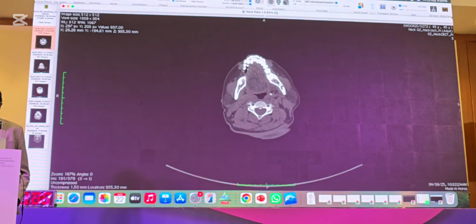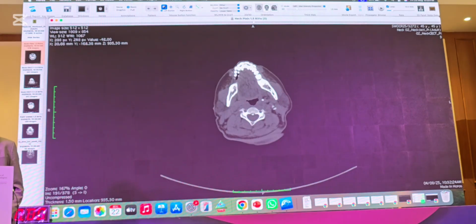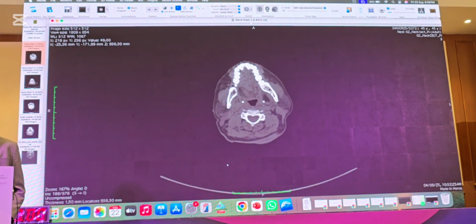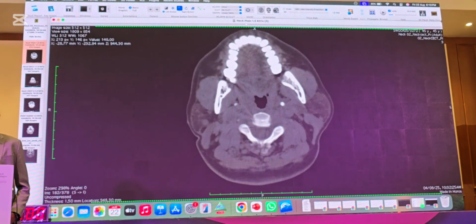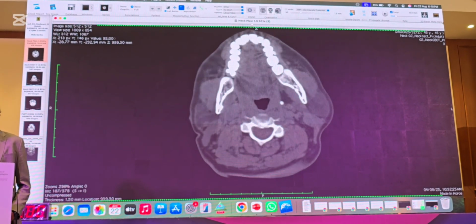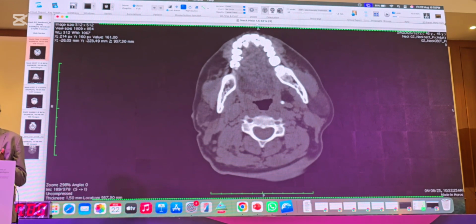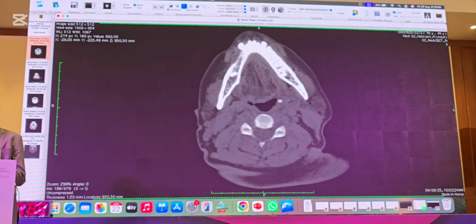So you can see here, this is the advantage of using DICOM. See here, I will just zoom it a little bit. So that's the maxilla. When you just scroll down, still you are seeing the teeth, and at one point you are able to see something on the inner side. So that's where the transition between the upper and lower teeth, that is maxilla and mandible, is happening. And this part is the mandible, lower alveolar margin.